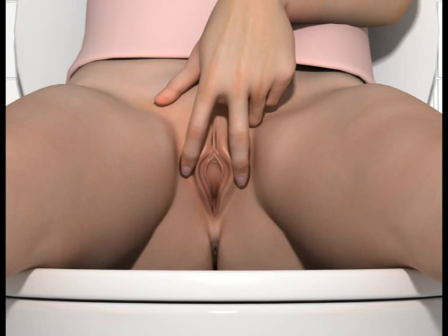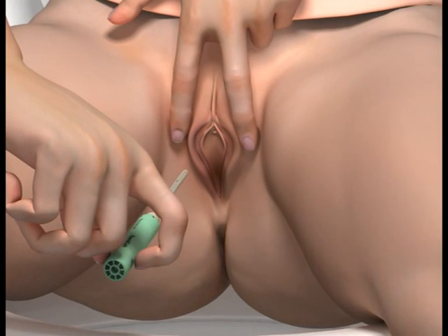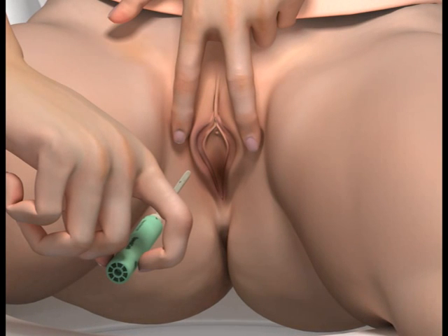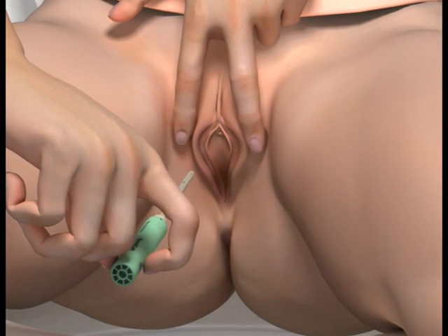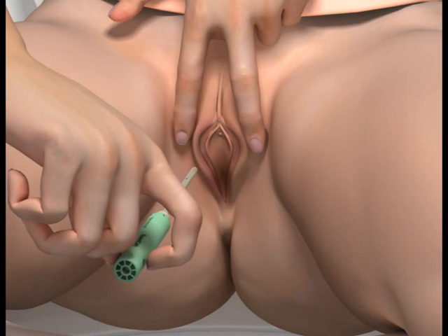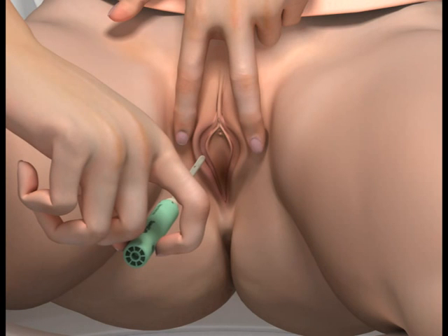Use each cotton wool pad only once. From this point on, keep your labia apart. Don't let the catheter touch anything before pushing it into your urethra. If it touches the sink or your clothes or skin, it could get dirty and cause an infection. If the catheter does touch something, you must take a new one and start again.